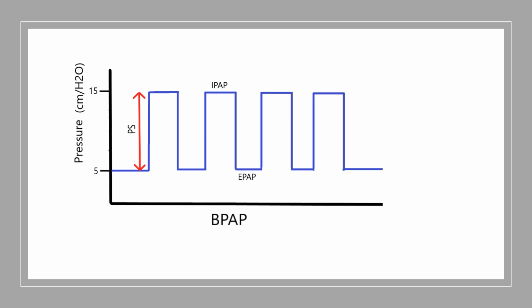The trick to it is getting the patient to sync. So unlike CPAP or a non-rebreather mask or BVM, some of these other more basic devices we use, BiPAP is beautiful, BPAP is wonderful, but you have to get the patient to sync. And so there are some other settings that are a little bit more advanced that we're going to talk about that can help improve patient synchrony.